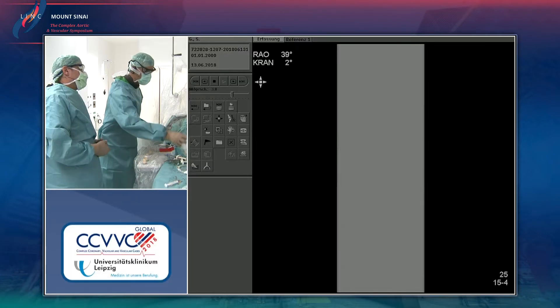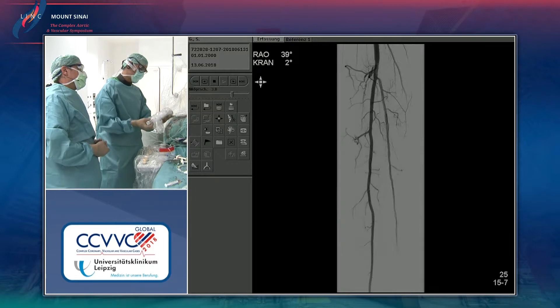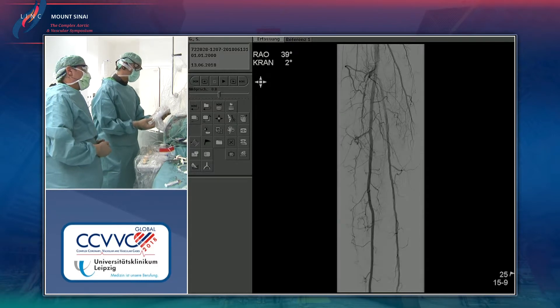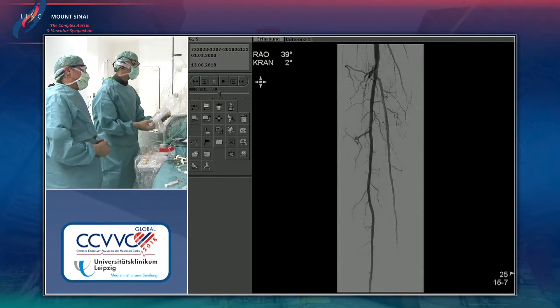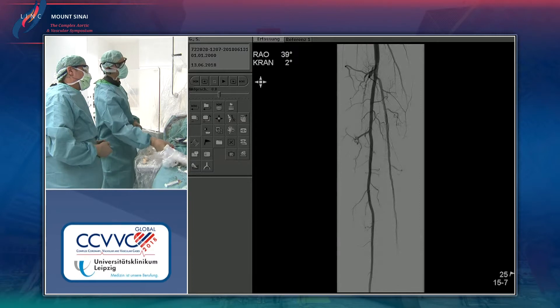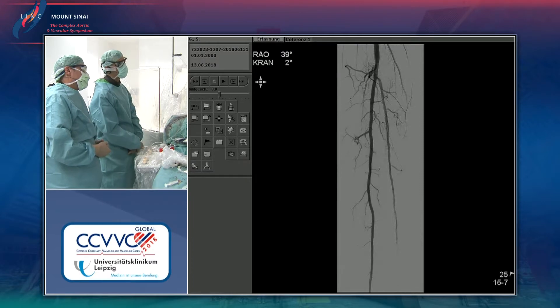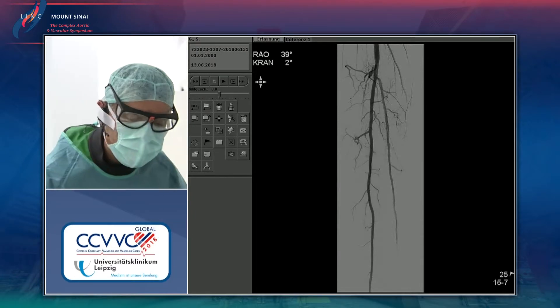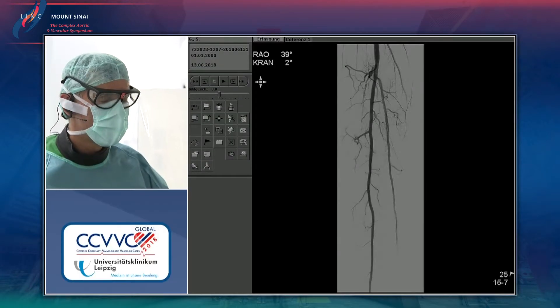The panel is asked for input. One panelist thinks it looks pretty good as is. A fluoroscopic image close to the ankle is requested to assess the result.